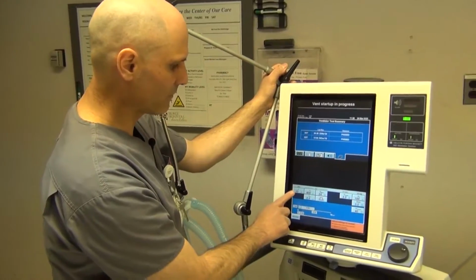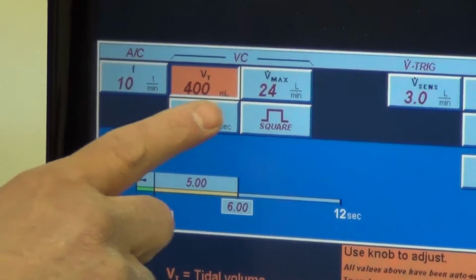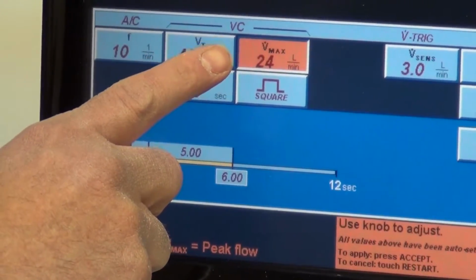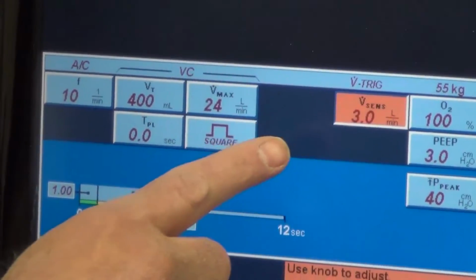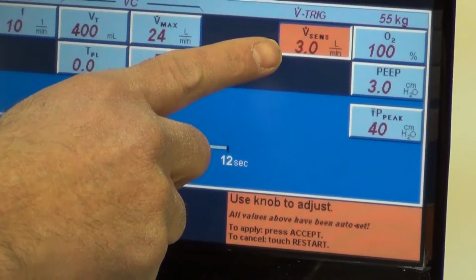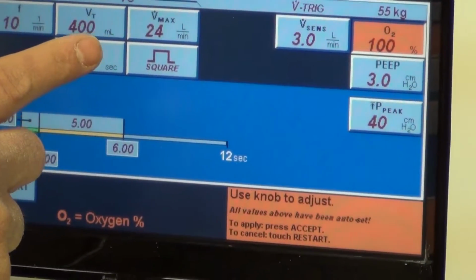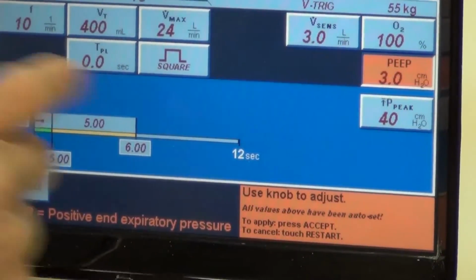This brings you to where you set the settings that the doctor will give you for the ventilator. You have several things here. You'll have your frequency, your tidal volume, your flow. This is one of the settings that the doctor will not give you, and I'll give you an average setting that we use. Flow sensitivity, that is for the patient to activate the ventilator to give a breath. That is also one that the doctor will not give you, but it's always default to this setting, which we will leave as it is. FiO2 is something the doctor will give you, and also the PEEP, which is right there.